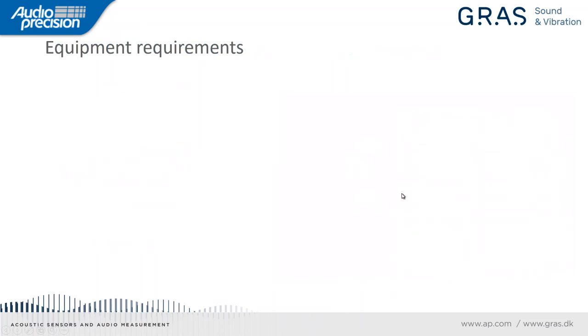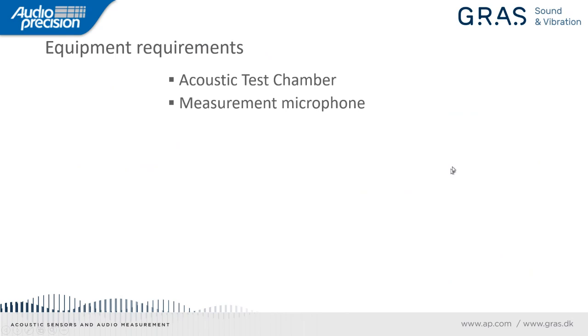Let's talk about the equipment requirements. So I've mentioned a test box or acoustic test chamber, and that's very, very fundamental to the test here. It's used to isolate the measurement environment from the ambient environment for noise reduction. It also has accessories built in to facilitate the testing.